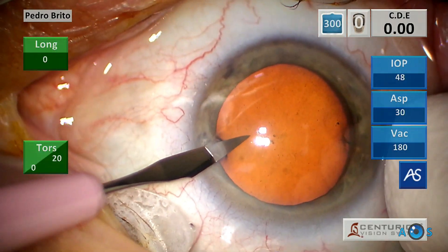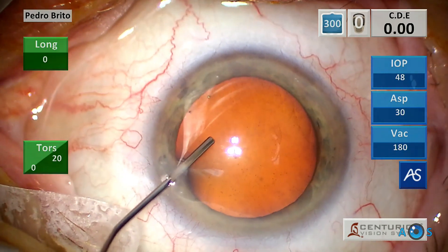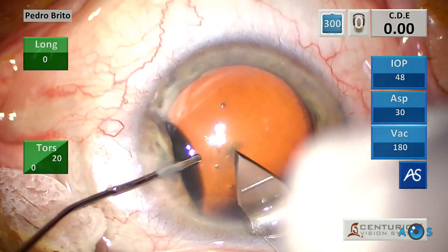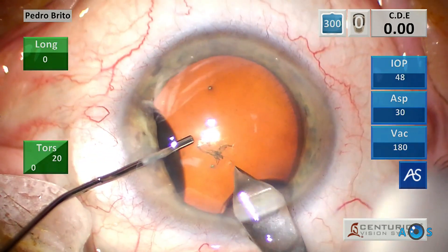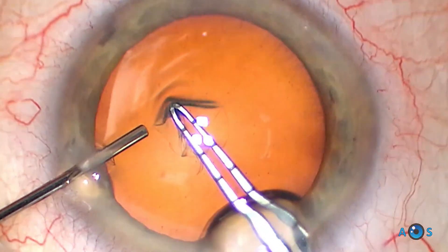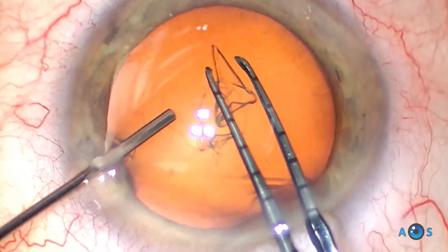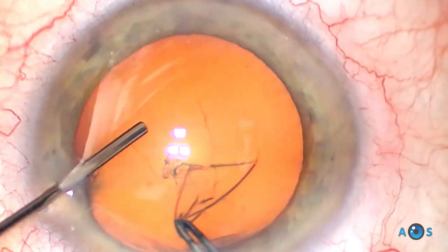This is one of the most advanced and modern FACO emulsification machines, based on a peristaltic pump system and offering an extensive level of customization for improved ultrasound energy and fluidics control. Such high level of technological features make this machine suitable for every cataract, from soft cortical to very dense brunescent cataracts. By combining the Centurion with the proprietary Revalue Operating Microscope, it is possible to record the machine parameters in real time during the various surgical steps.